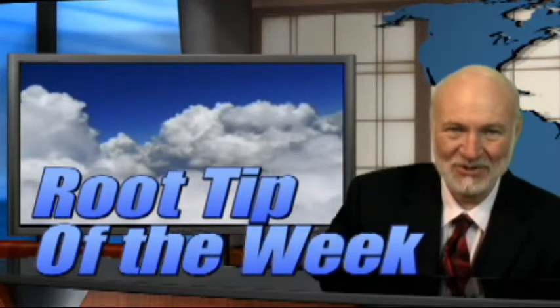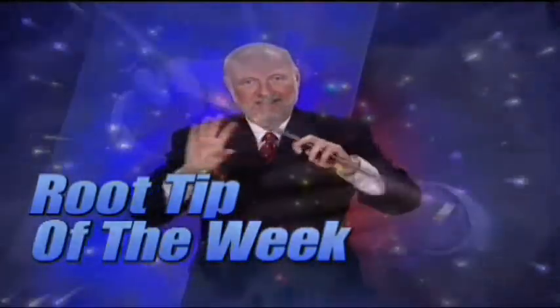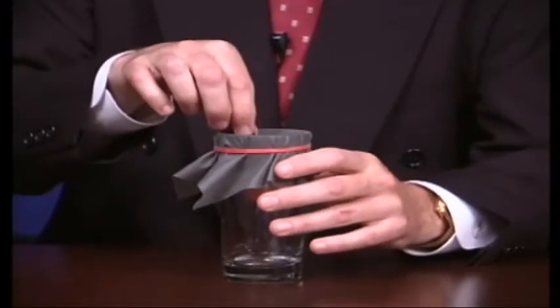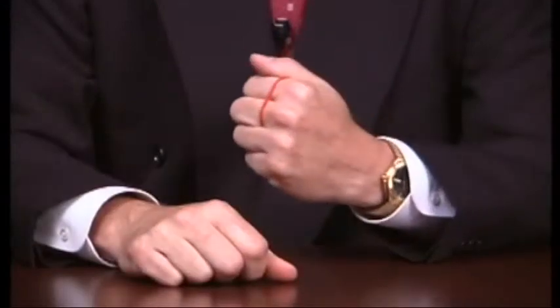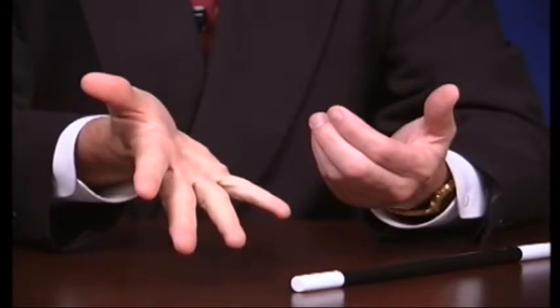Hi, I'm Dr. Kit Weathers, and it's time for the Root Tip of the Week. I'm Dr. Kit Weathers again with the Root Tip of the Week, and today we're going to be talking about the EndoGripper. The EndoGripper is a handpiece that's designed to allow you to grab or grip a standard hand file after the file is in the tooth.